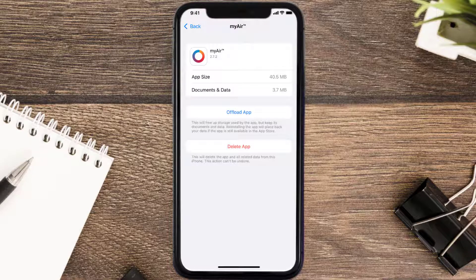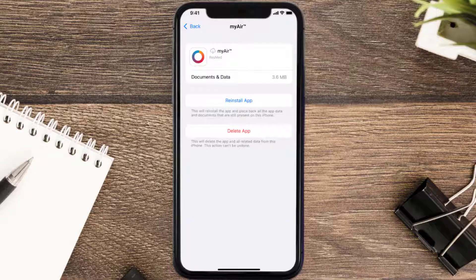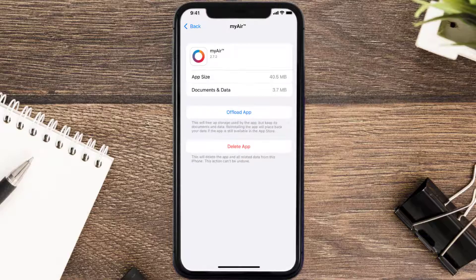Once you're on this screen, tap on Offload App, then tap again to confirm. It'll take a bit for processing, and then a Reinstall button will show up — simply tap on it to reinstall the app. This should fix the issue.